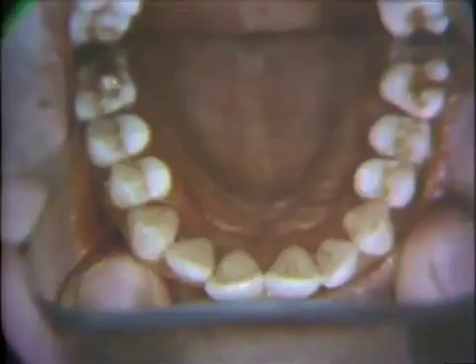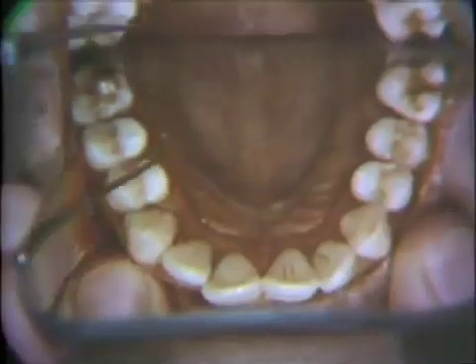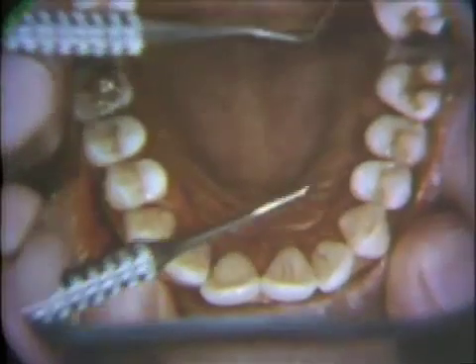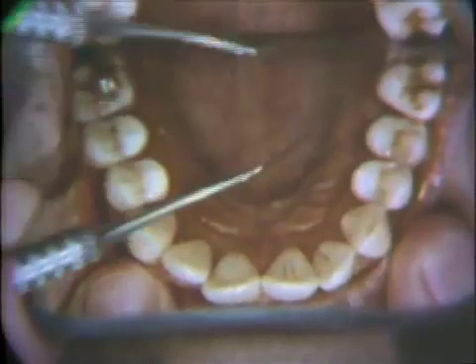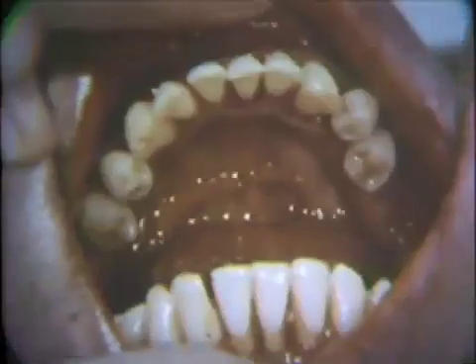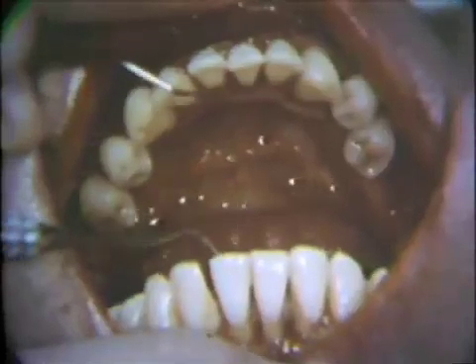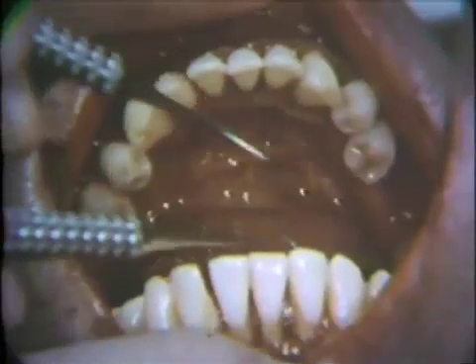The patient is also instructed in detailed home care procedures; however, this is the subject of a separate film and will not be demonstrated at this time. The lingual and palatal surfaces, as well as the labial and buccal surfaces of the teeth, are carefully checked for residual stain.